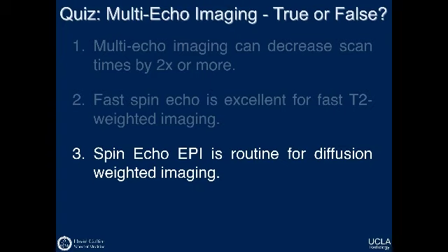Spin echo EPI is routine for diffusion weighted imaging. True. Whether or not diffusion weighted imaging is used for a particular protocol is more of a clinical question, but spin echo EPI is the basic sequence that underlies almost all diffusion weighted imaging.